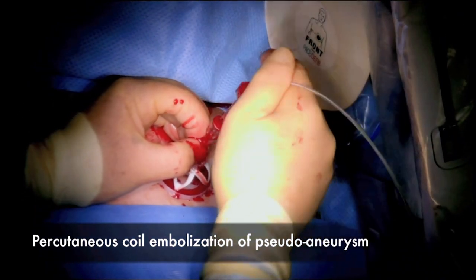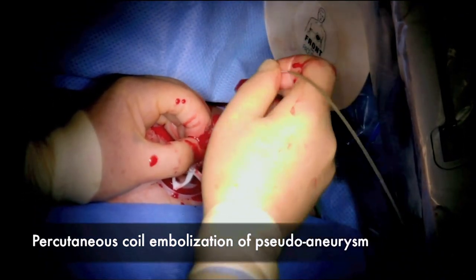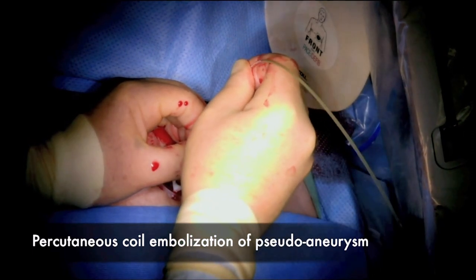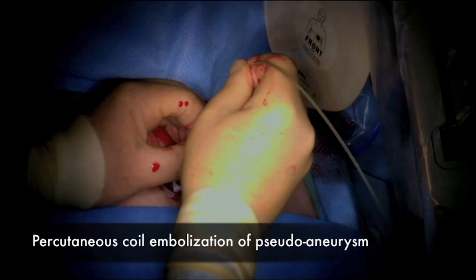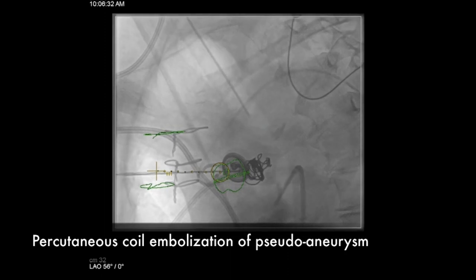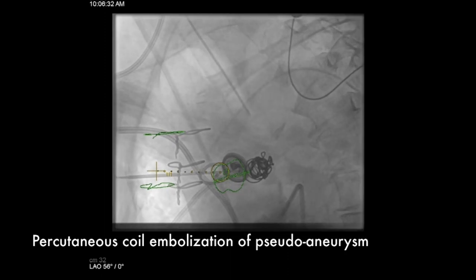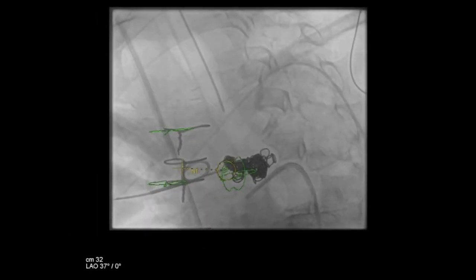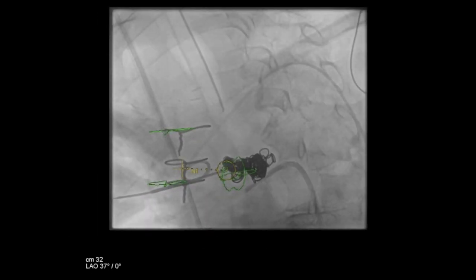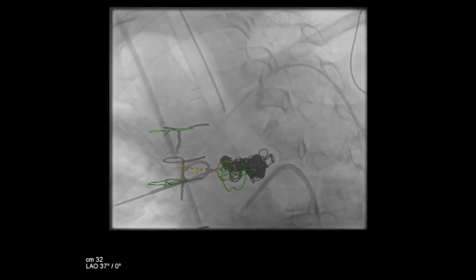We then attach the Tuohy-Borst adapter and place a series of detachable coils, which we advance straight into the pseudoaneurysm cavity. Here you can see we're filling up the pseudoaneurysm cavity. We used a total of about four or five coils, and we coiled back the embolization pathway slightly.